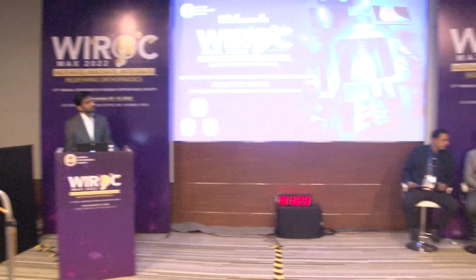When you said that in 4 cases the system went wrong, what happened? How do you make out that the system is wrong? So there are snags. For example, you can't move from the planning screen to the execution screen because the system is saying, I can't pick up the markers. So it's a technical problem there. For example, in one of those cases, we had loss of electricity. The system's supposed to reboot, but it didn't reboot.